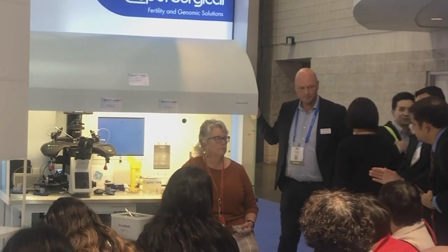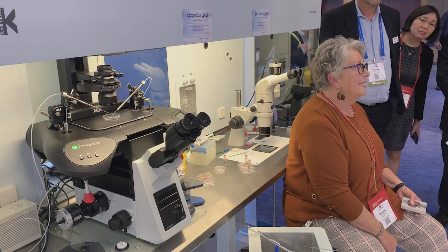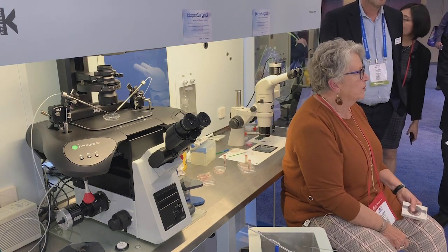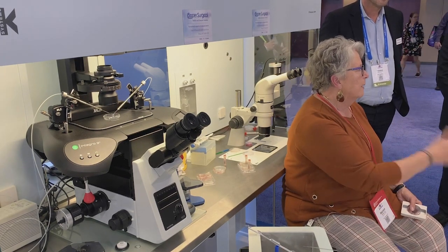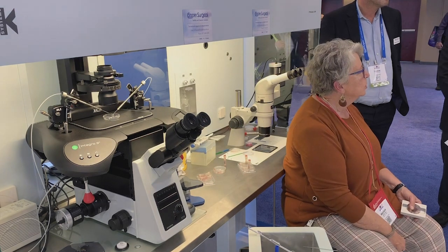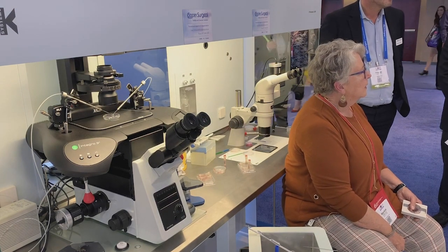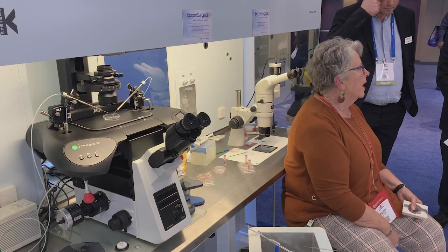Do you touch the eggs when they are in this TS? Do I touch the eggs? Yes, I will move eggs around in the TS. I want to make sure I know I have it and I'm ready to go, because when that minute ends, you want to... Do I make a circle? No, did you touch them actually, or you just kind of circle around them? Oh, no, I'll pick them up and move them around in the TS.